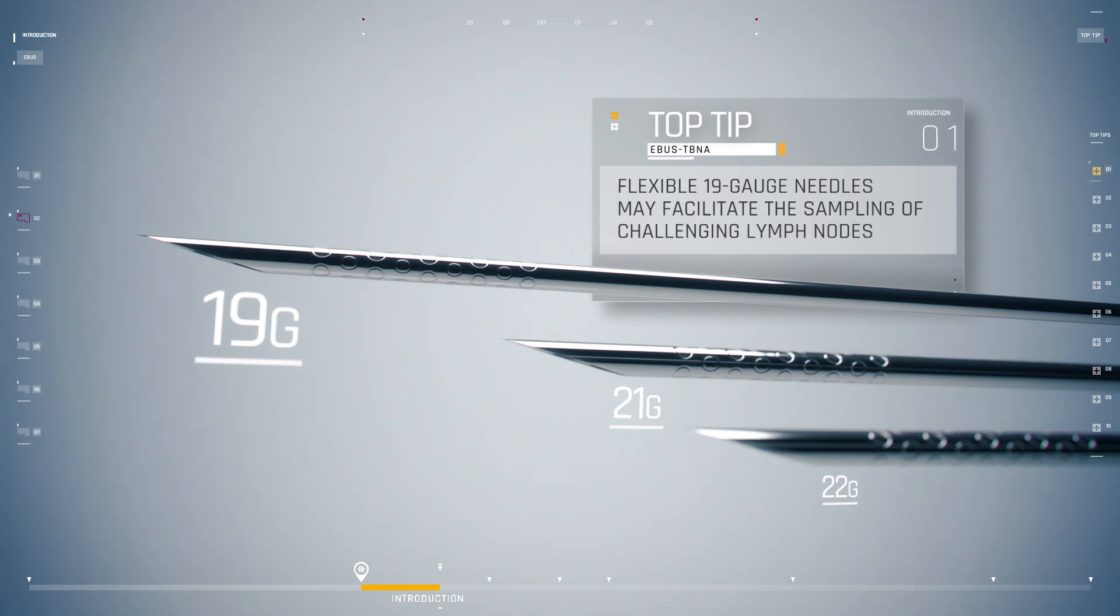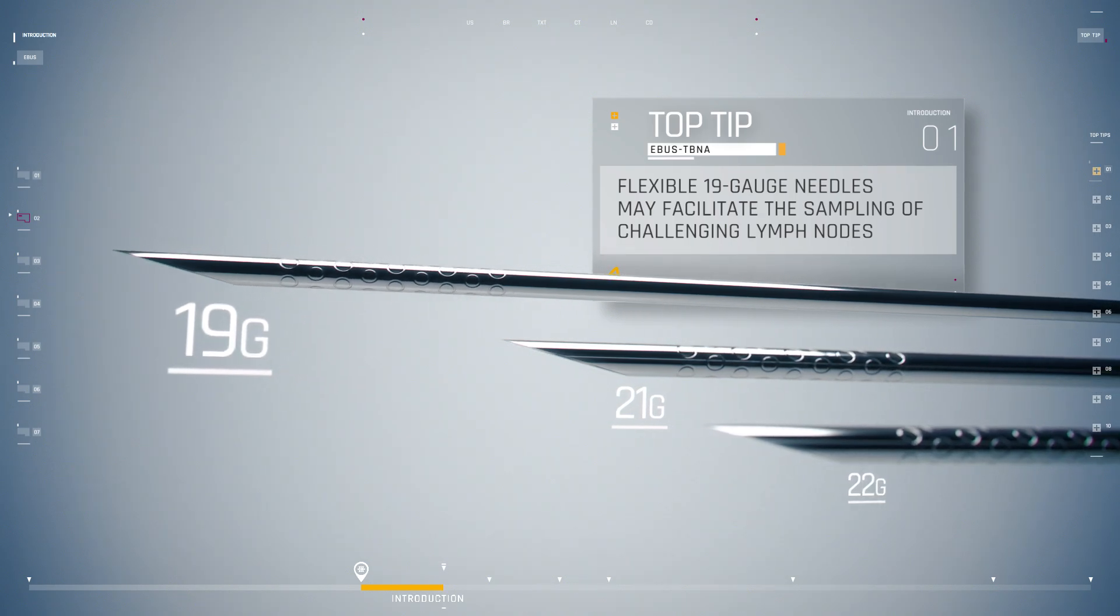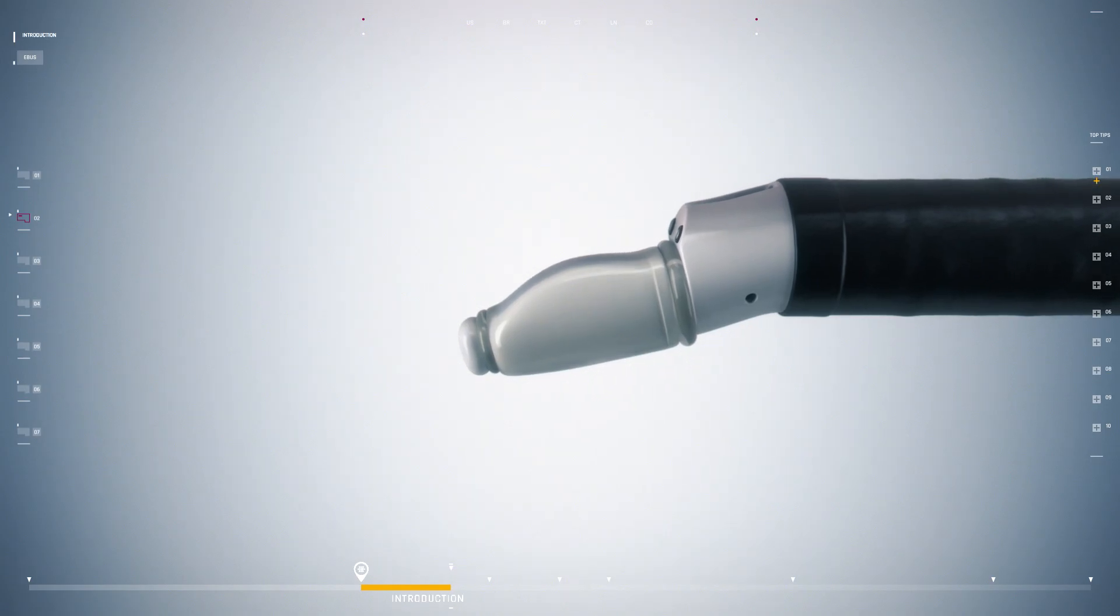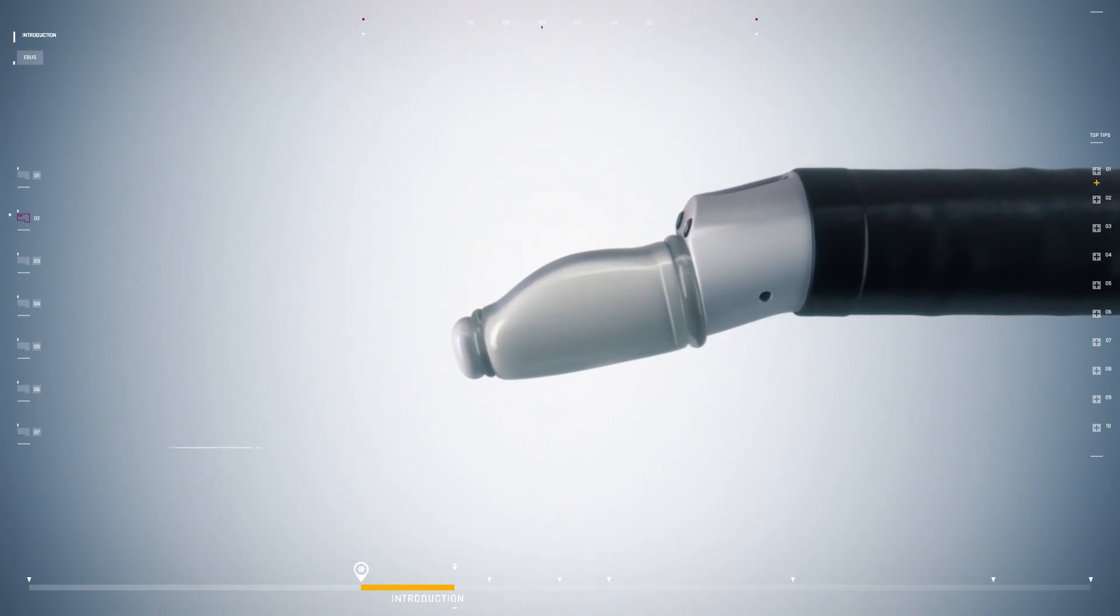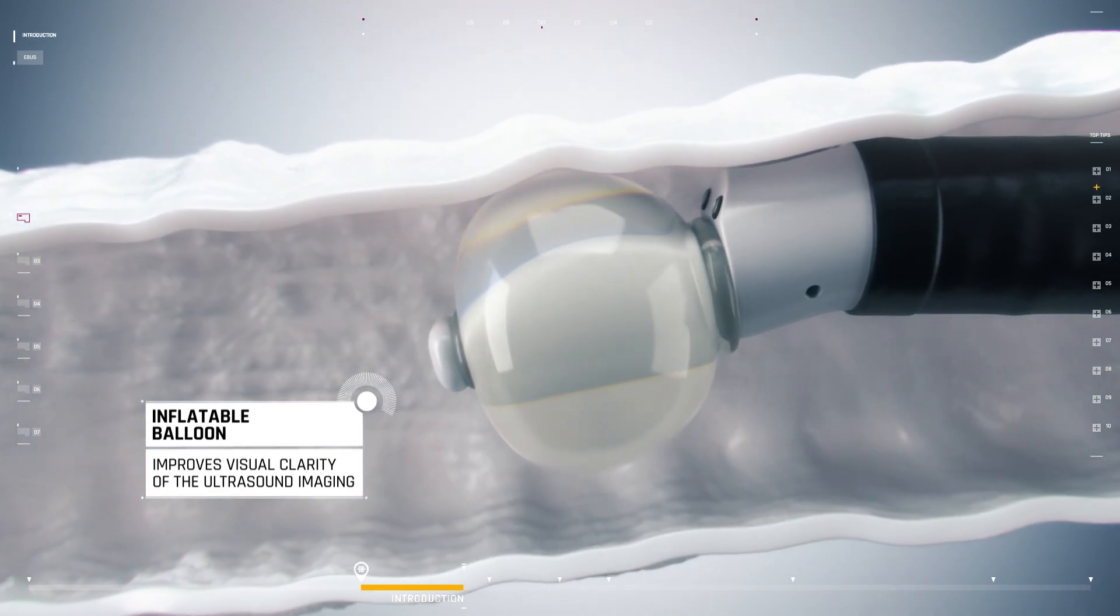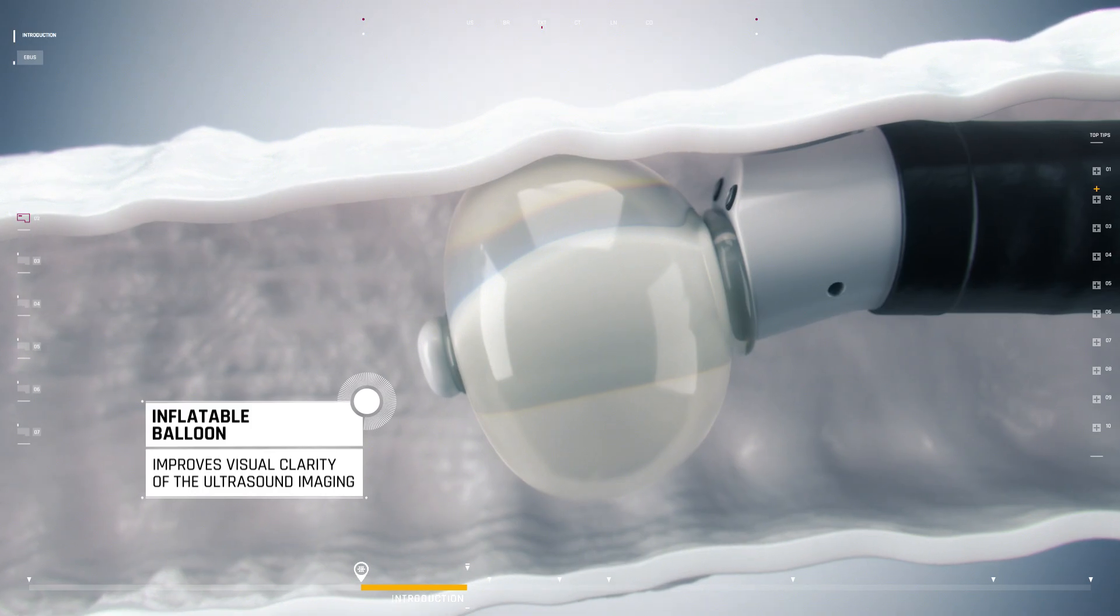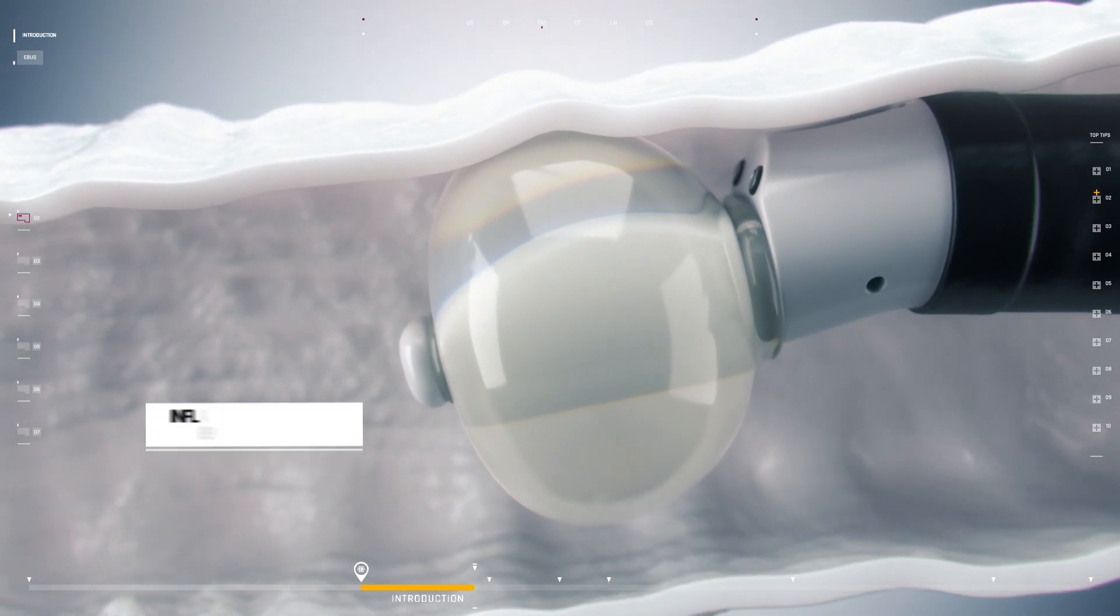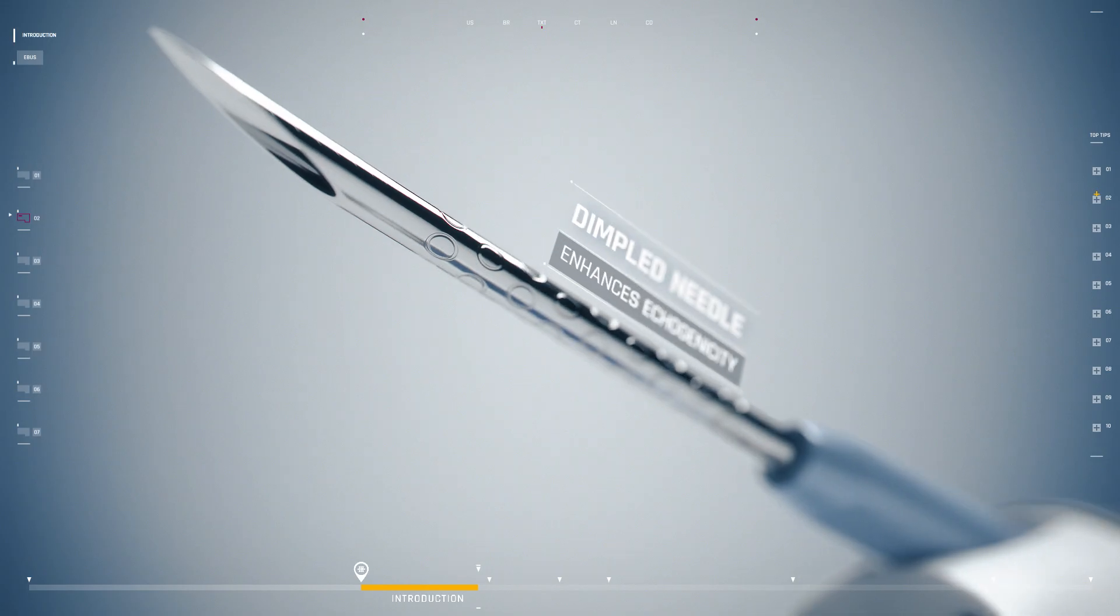The bronchoscope has specific features that improve visual clarity. A disposable balloon can be placed over the ultrasound transducer and may be filled with sterile water or saline to facilitate acoustic coupling between the airway mucosal surface and the probe. The needles have multiple small dimples on their shaft to enhance echogenicity and improve visualization on the screen.